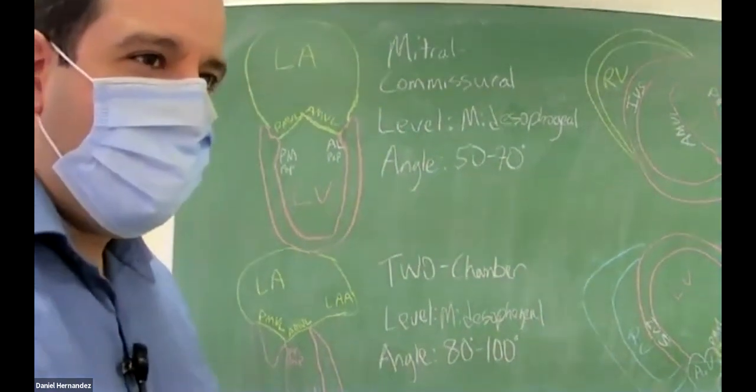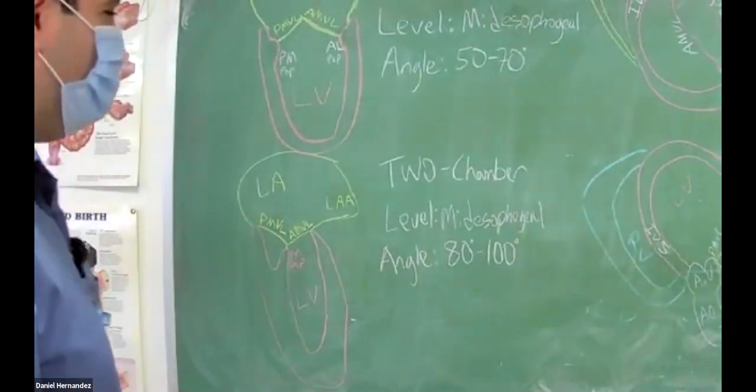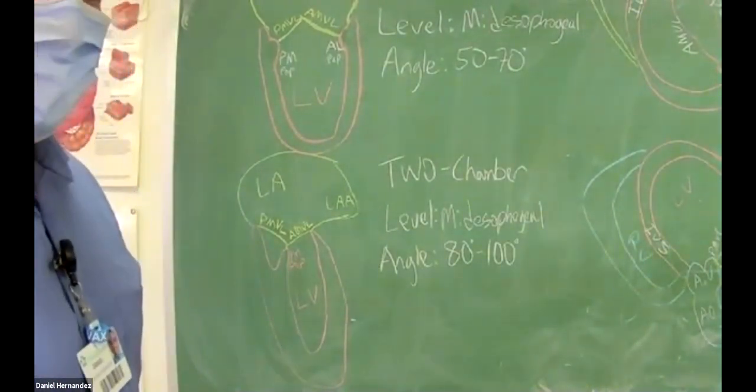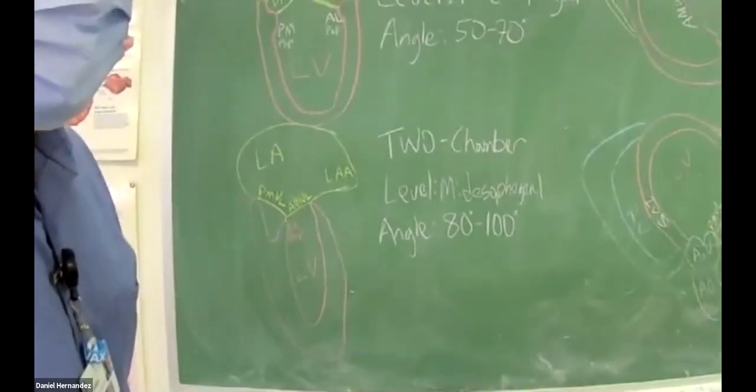I also did the two-chamber view from the mid-esophageal level. I wasn't sure if I stole that from someone too, but does anyone have the two-chamber view? No? All right, good.